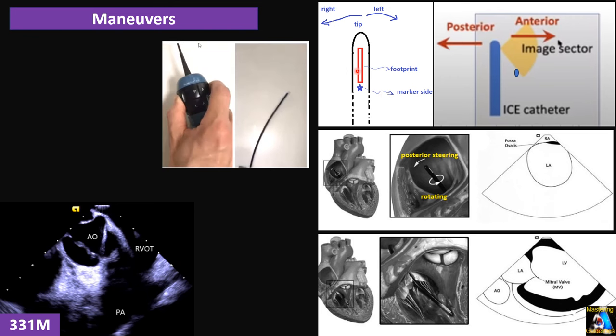Despite the therapeutic anticoagulation, careful imaging of the sheath before advancing into the atrium is always obtained. In this case, a small mobile clot is seen and marked by a red arrow at the tip of the second transseptal sheath. The sheath is retracted, aspirated, and the clot is recovered and shown in image B2.